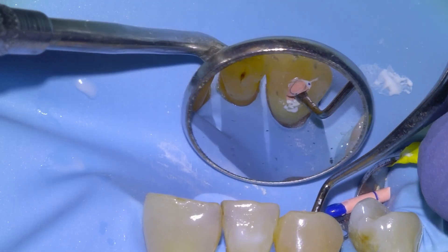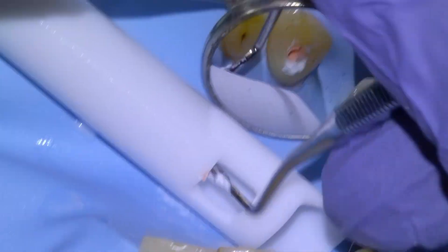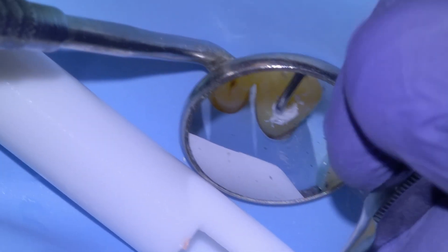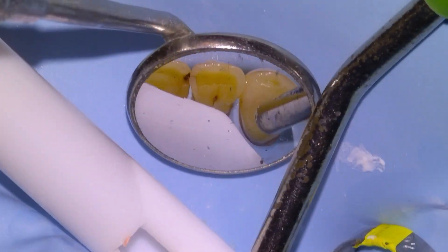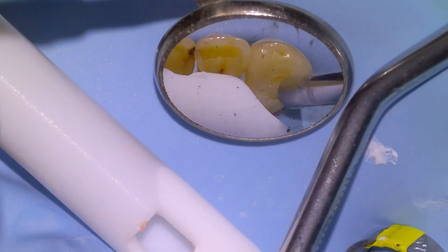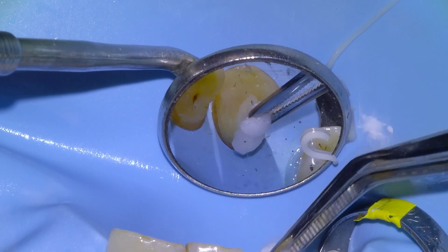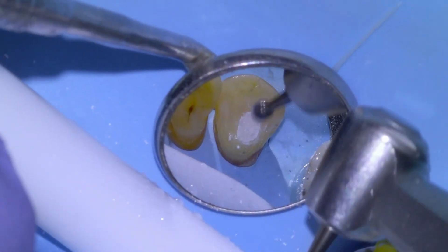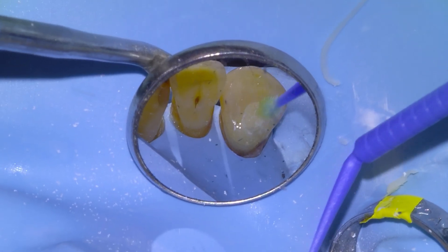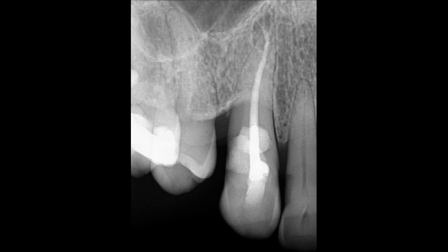I'm going to snip the excess and then sear off the remainder with a heated plugger, packing it down until we have a good four or five millimeters of space to restore the access cavity. I'll clean it up with a high-speed round and then etch and restore. I'll use Fuji 2 here since it's a fairly conservative access — I think glass-based restorations have the best seal so that's pretty much all I use. We'll finish off the restoration until we're back on the natural margins, cure it, remove the rubber dam, take a final x-ray, and dismiss the patient. We're anticipating good healing on this one — I'll probably take an x-ray in a year and hopefully see the bone grow back.